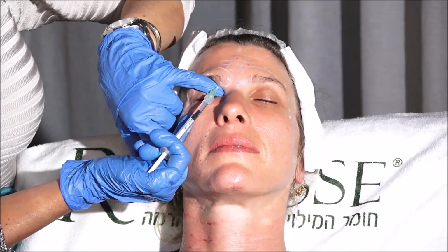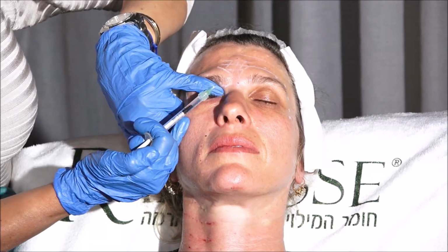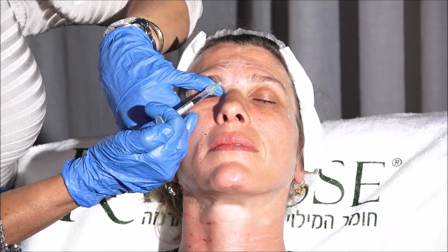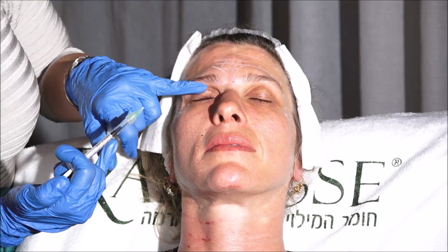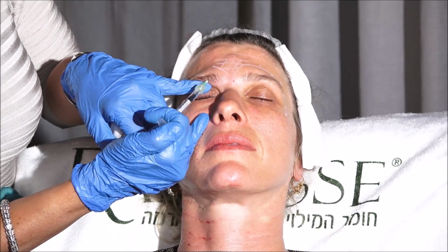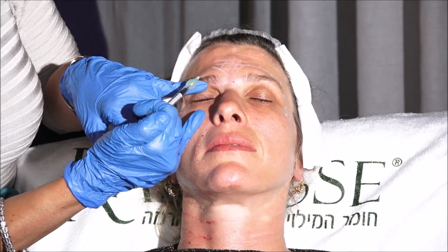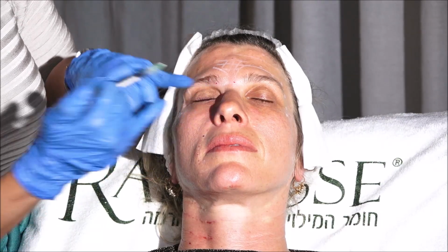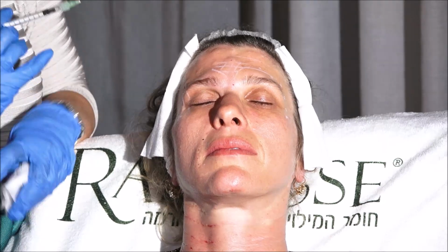To the skin, I would go like this or like this. I need to mark the orbital rim and go 90 degrees to the orbit and give the 5 units. I protect here again, and I go full needle in, half a needle in, or 2/3 of a needle in, and here I go 90 degrees, 1/3 of a needle in. And this is how I do the glabella.